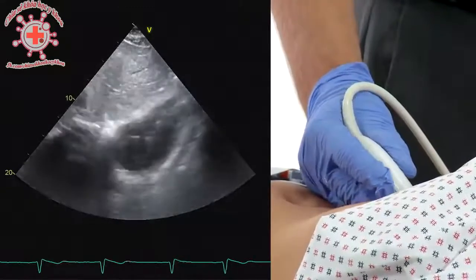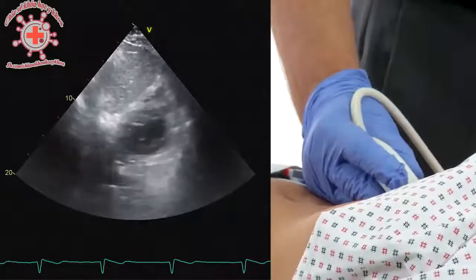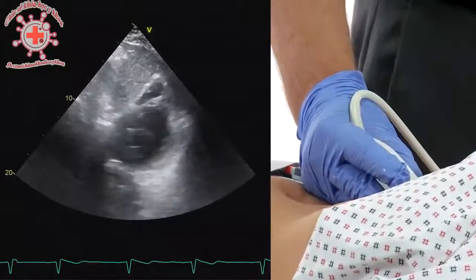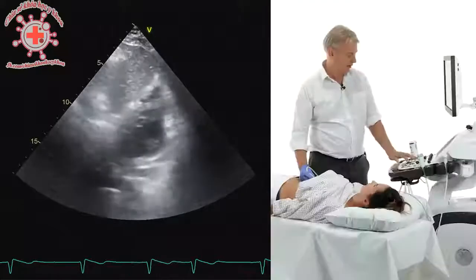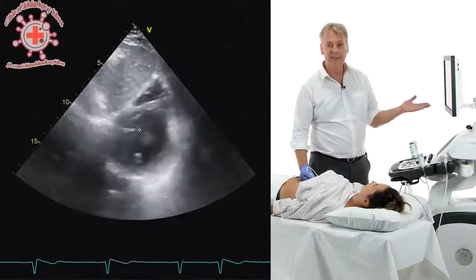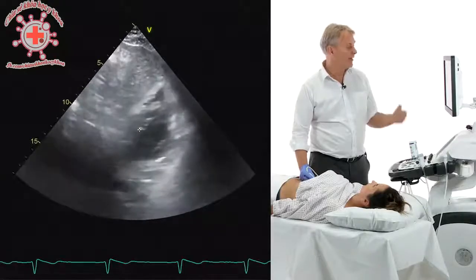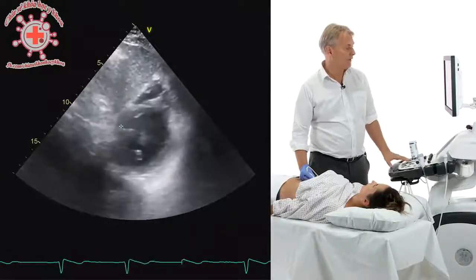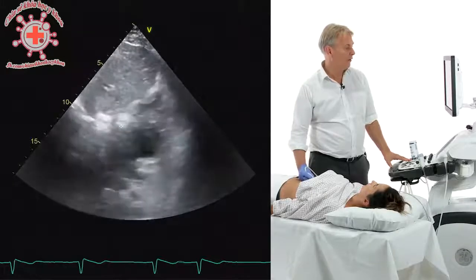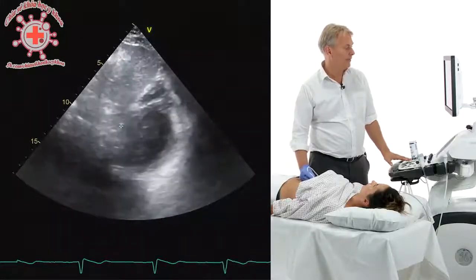All of a sudden, you will get a short axis view of the left ventricle. Now, this short axis view looks very much like the parasternal short axis view, with the right ventricle right here and the left ventricle right here. So here you can actually assess circular or radial function of the left ventricle. And you can scan the ventricle by going back and forth from the base to the apex.